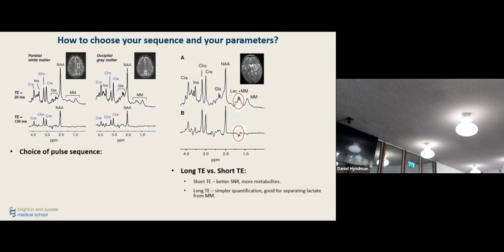How do you choose a pulse sequence? Well, that's a very long story and a very long debate. Put 5 MRS scientists in a room, have them fight with each other. What's the best sequence? Not for us to choose now. There is the accuracy of localization, sometimes metabolites of interest, sometimes specific absorption rate is an issue. So, for example, semi-LASER is a very good sequence.